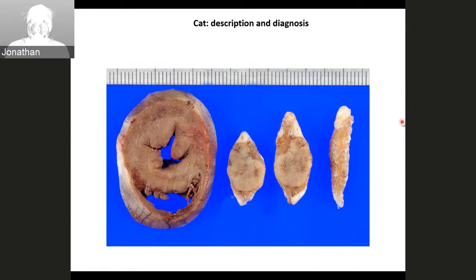So obviously a normal thyroid gland with a parathyroid, and in the middle and on the left, we can appreciate two glands that are abnormal and heterogeneous, thickened compared to the normal ones. There is a tissue that is whitish and slightly heterogeneous, replacing the normal tissue.